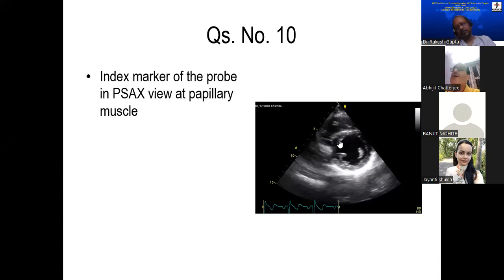Now, what coronary artery supplies each of these segments? Anterior and anterior septum is supplied by LAD. Yes. And the lateral and posterior? Circumflex. And the inferior and inferior septum? RCA. Actually, PDA. PDA may be from RCA or it may be from left circumflex. Okay, done.